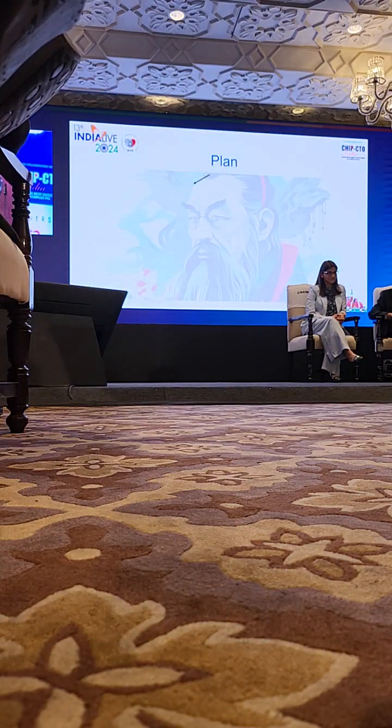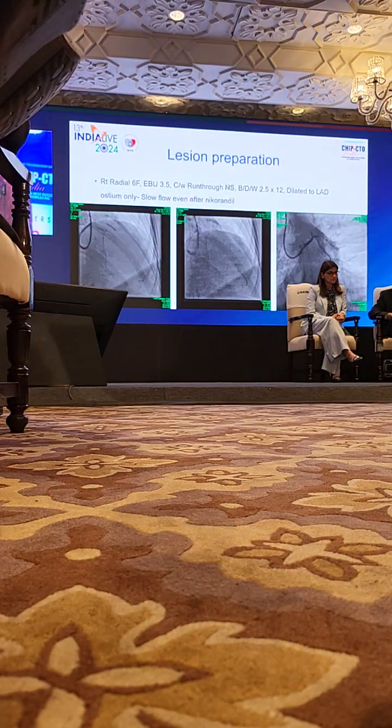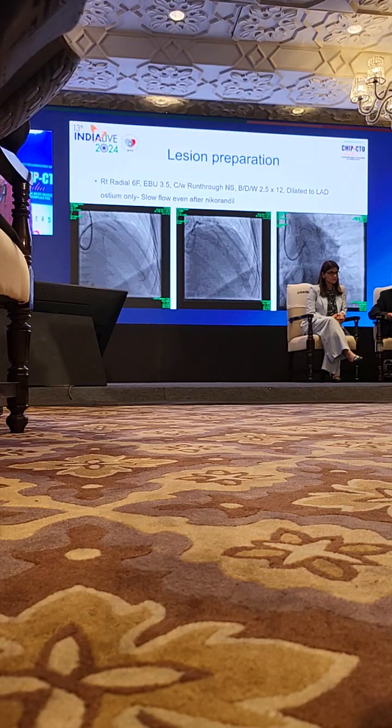So we had a decision to make. Do we plan the whole thing in a complex way and take into account all these considerations, or, remember, it's a primary PCI, keep it simple, quick in, quick out, and finish with established treatment? Initially we chose the latter. So right radial, 6F EBU, run through. We dilated with the 2.5 by 12. Dilated up to the LAD ostium only. There was some slow flow even after nicorandil.